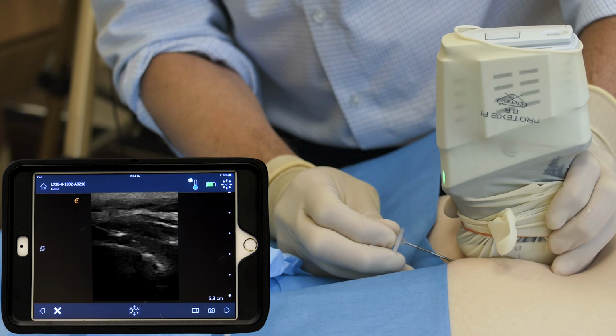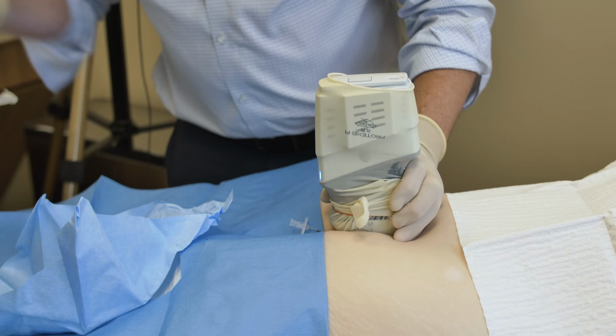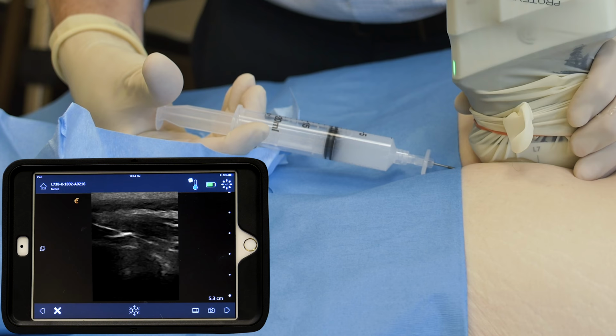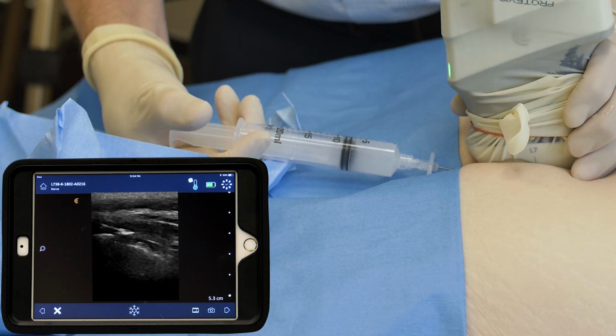I was drawn to pain management because this is a field in which I can make an impact on my patients' lives. I knew that by finding a pain generator and treating the pain generator, I could in effect enable the patient to be more active, take less medications, and perform their activities of daily living. Some backflow, but that's normal. Nice smooth injection.